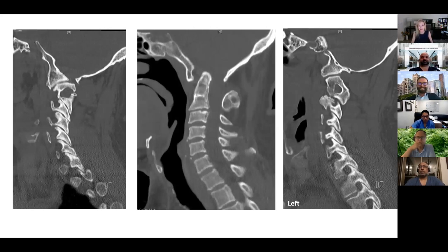You probably have a widened, I think that's kind of a midline. Well, it looks like your C1 might be fused to your clivus there, right? Is it fused? Correct. I don't know if that anatomy might be the way he lives. It might not be traumatic. Probably no prevertebral soft tissue swelling, so I bet that is his normal state.